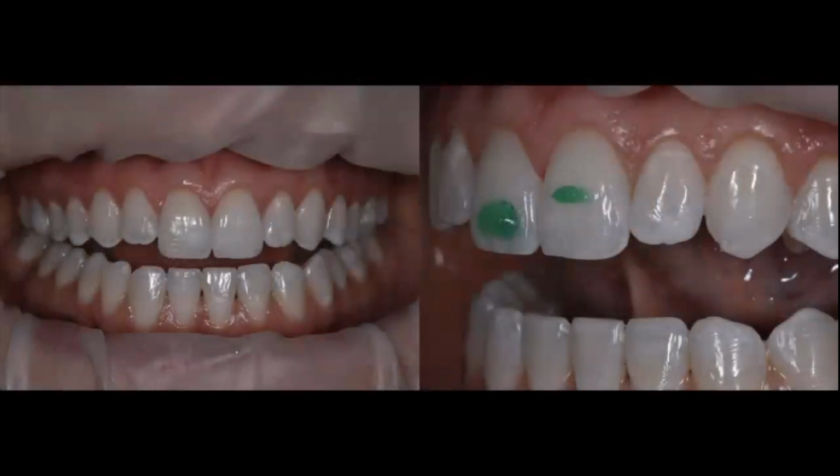I like using rubber dam, but in this particular case, I decided to use these lip retractors made by Ivoclar, Optragate, and once everything was retracted, just because they were very small, I had good control of the area. I went ahead and started doing my resin infiltration using that hydrochloric acid gel that comes in this kit, and you leave it there for a couple of minutes.